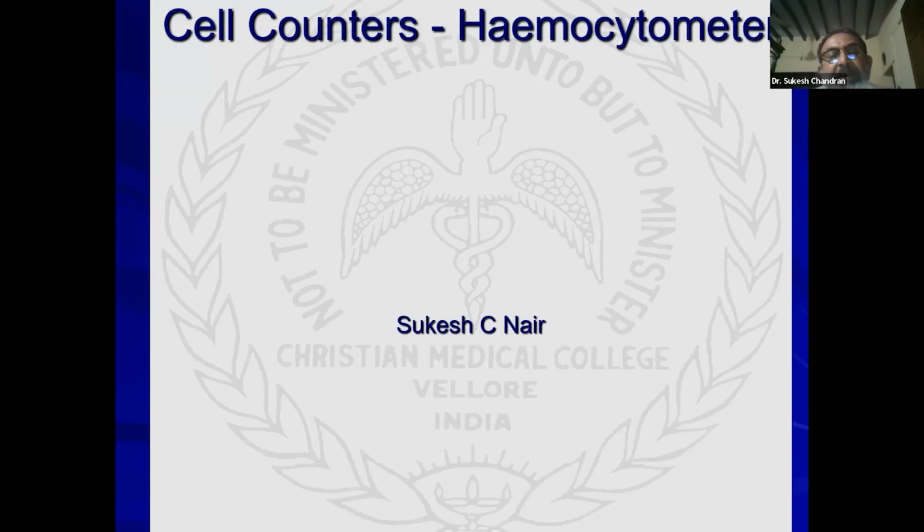So basically, you should realize that it is counting and giving you objective values from the blood. But most of the people only look at the counts and report on the counts. Maybe look at the peripheral smear. Peripheral smear is an artifact because you make a smear. The spread of the cells is based on the weight of the cell and the attached affinity to glass. So it's an artifact, and you're trying to correct something which has been objectively derived from the cell counter with your peripheral smear. So I just wanted to go through some of these hemogram interpretations to convince you that please look at more than what the cell counter does.